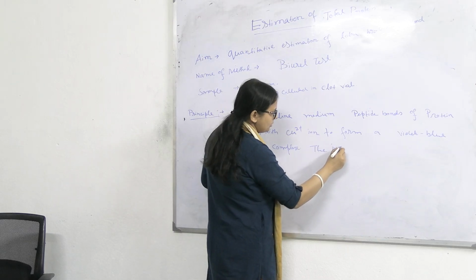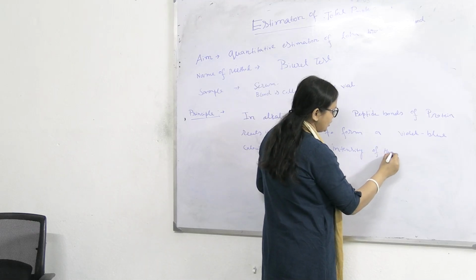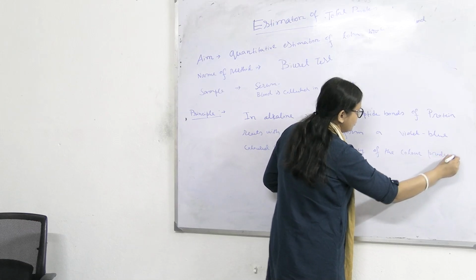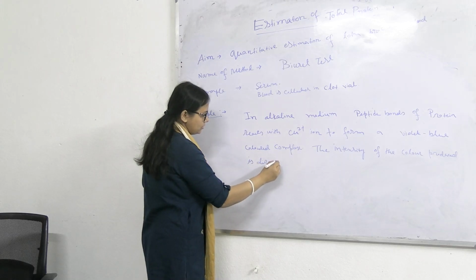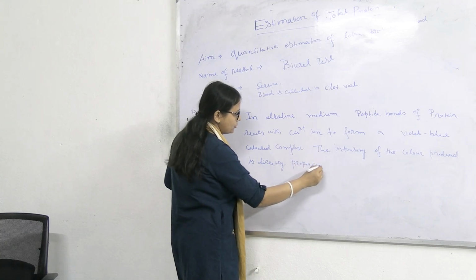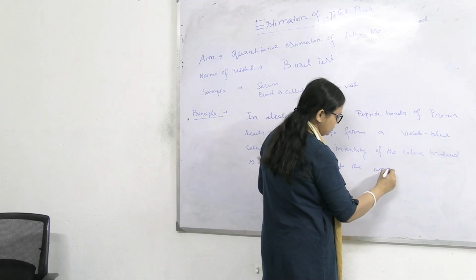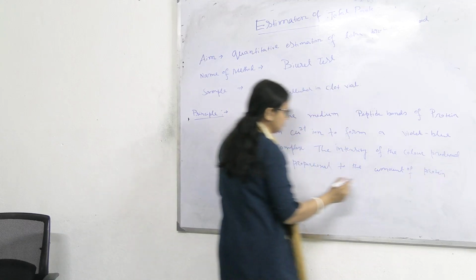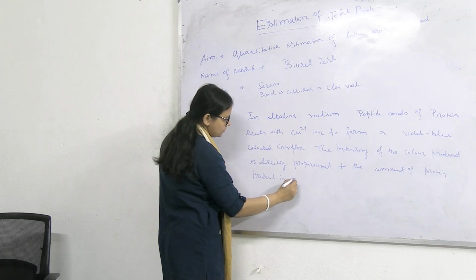The intensity of the color produced is directly proportional to the amount of protein present in the sample.